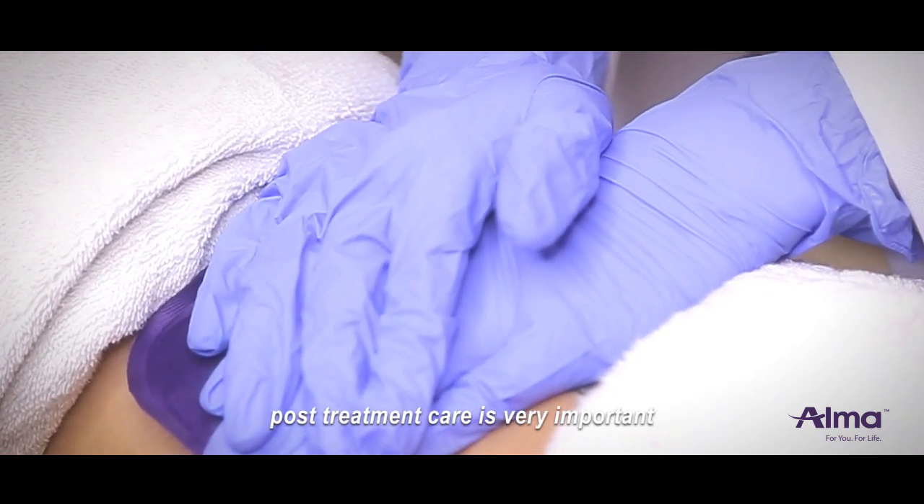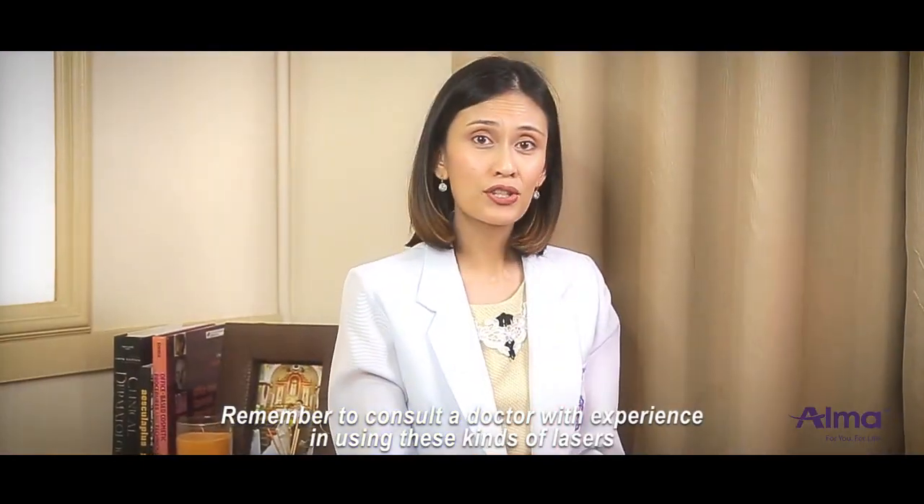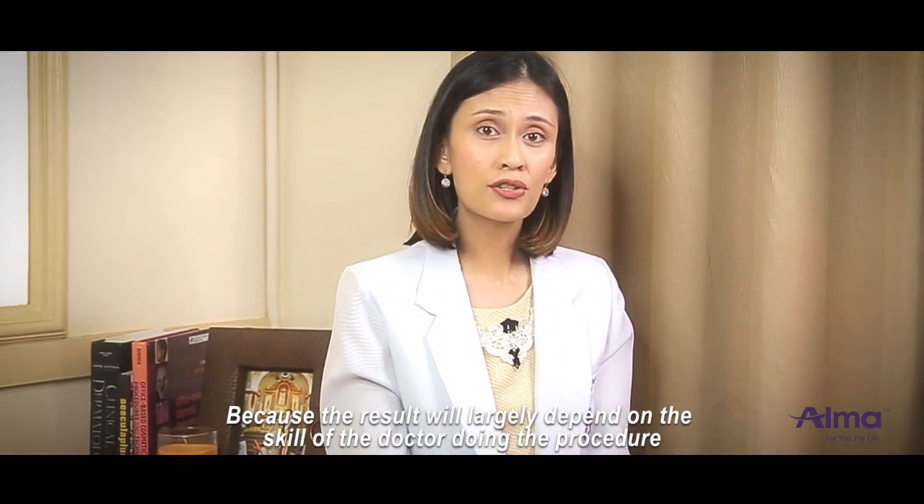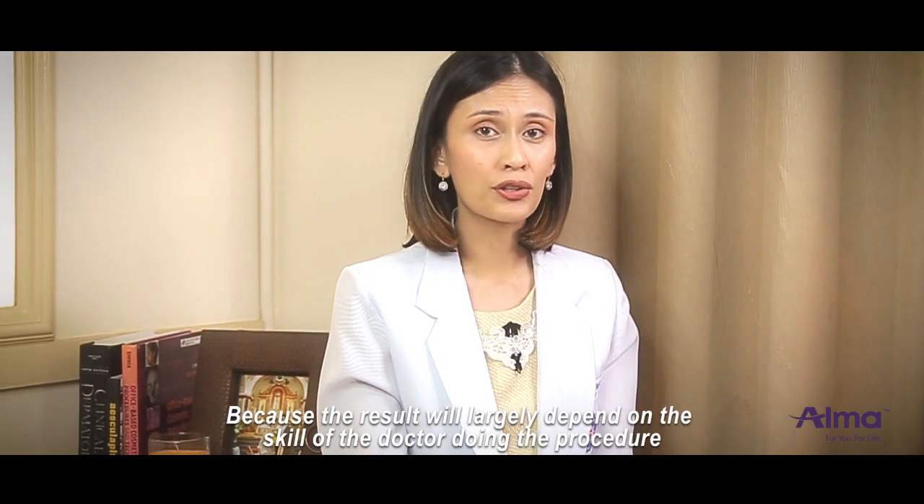Post-treatment care is very important. Remember to consult a doctor with experience in using these kinds of lasers, because the results largely depend on the skill of the doctor during the procedure.